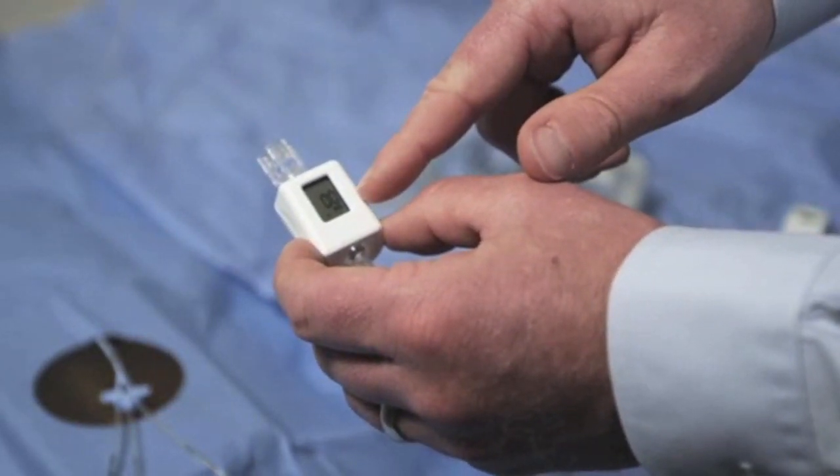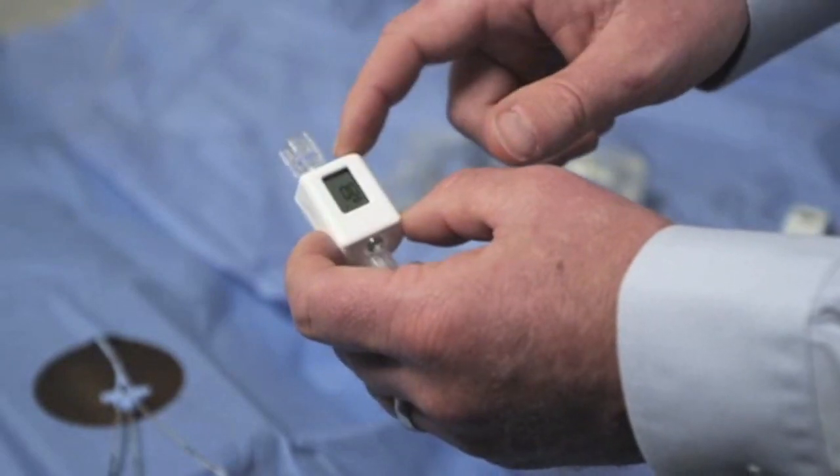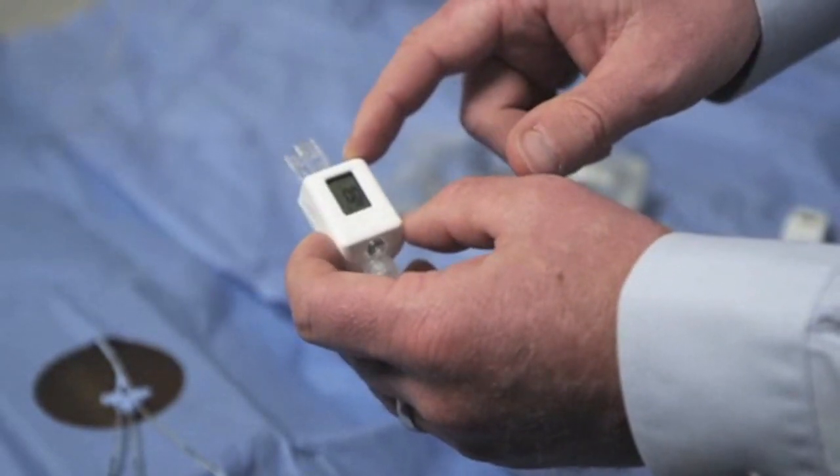Also important during this step is to make sure that at least one end of the device is open to atmospheric pressure, such that it calibrates accurately.